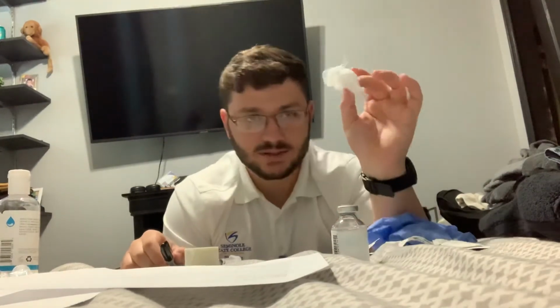So to begin, I have my alcohol, well, my unused alcohol prep pad. I have my gloves. I have, well, it's not really a supply that I would verbalize, but I have my patient. I have my sanitizer. I have my label, my pen, gauze in case there is bleeding, and then, yeah. So, let's see. Is there anything else?